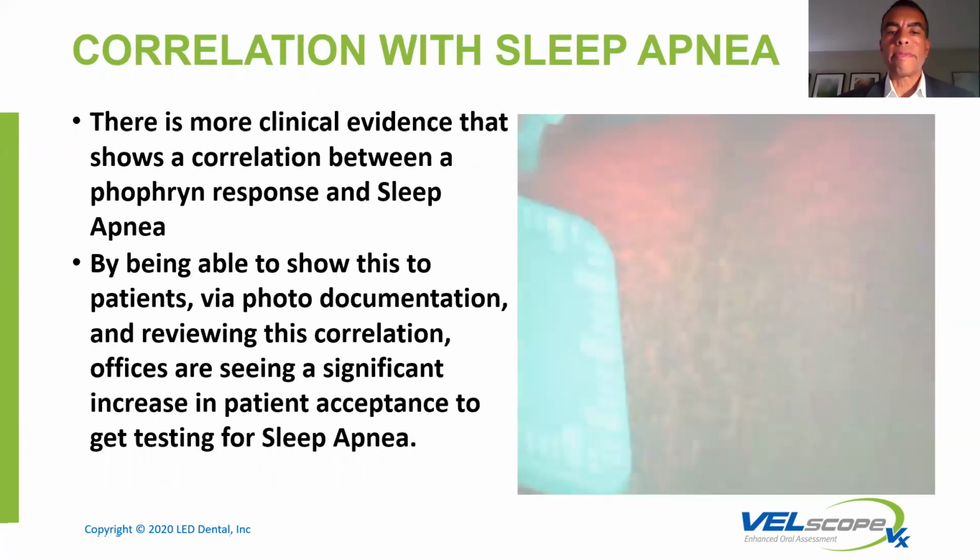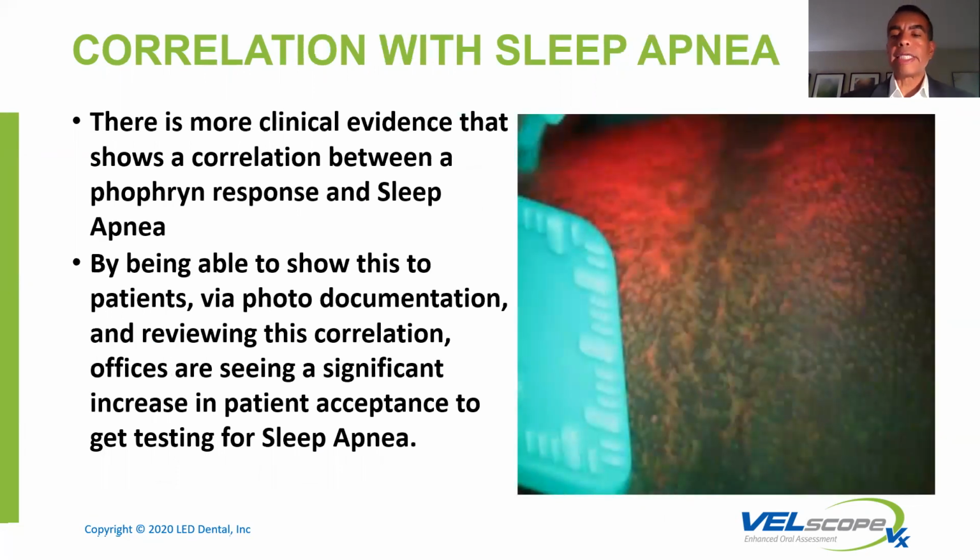One of the things we're really excited about that seems to be growing in terms of evidence is this correlation with porphyrin and sleep apnea. What we're finding is that clinicians who are now utilizing this, when they see the red, say, Ms. Smith, I see what we call porphyrin, which some studies are now showing a potential correlation with sleep apnea.